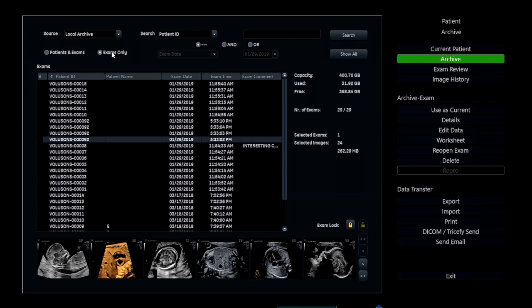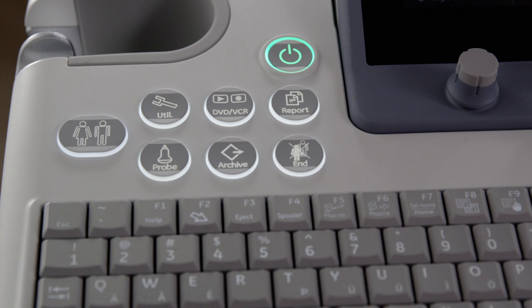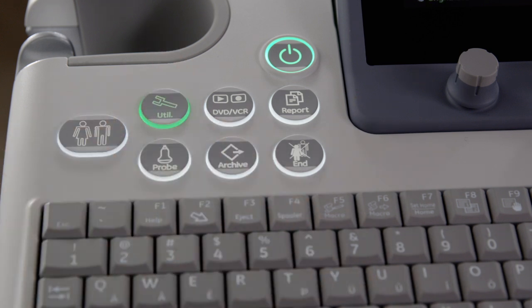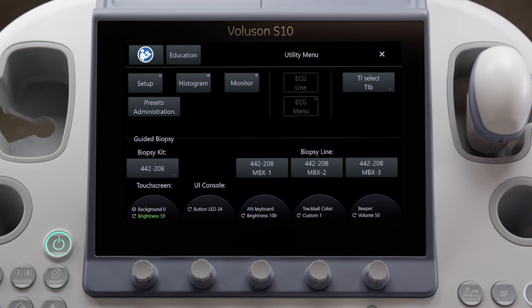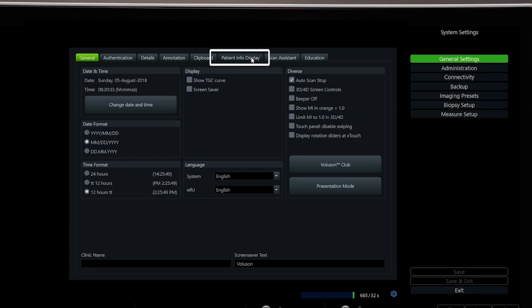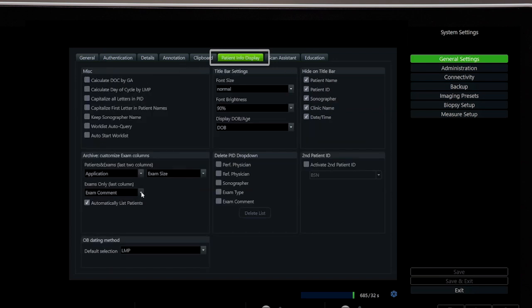Comments listed in the exam list can be helpful to identify interesting or unique cases. This last field can be customized with other options, programmable in the Utilities menu under Setup, General Settings, Patient Info Display.